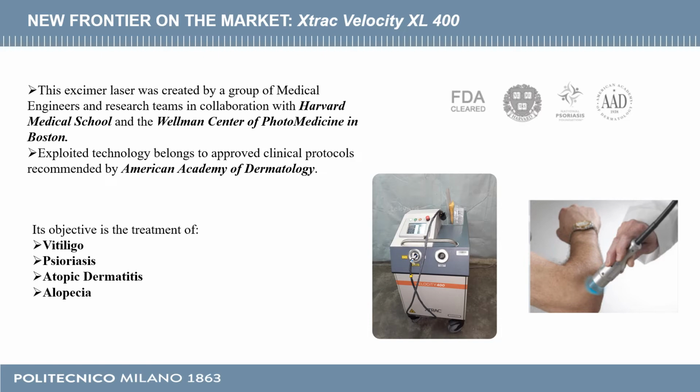One possibility, which has been introduced in the context of a leading technology, is the X-Track Velocity XL 400, which is an excimer laser that has been proposed by a group of medical engineers and research teams in collaboration with the Harvard Medical School and the Wellman Center of Photomedicine in Boston.